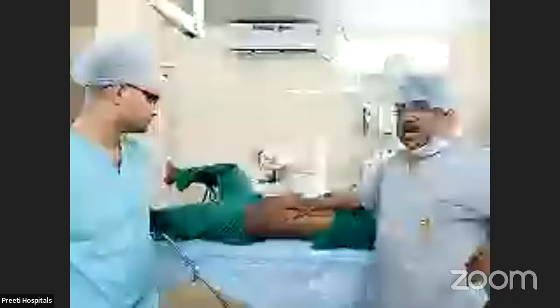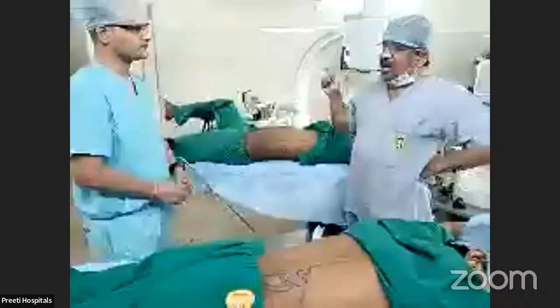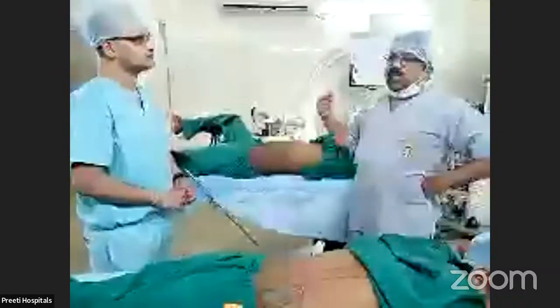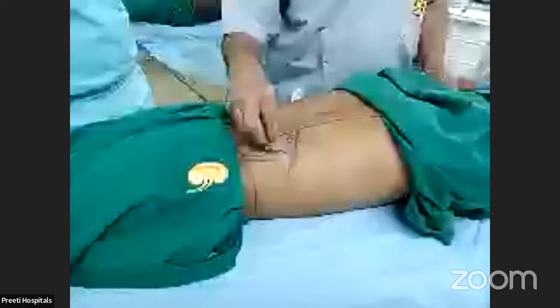So for all practical purposes, an inferior calycial stone is a disadvantage for supine PCNL. A large inferior calycial stone is a disadvantage for supine PCNL. A small inferior calycial stone is better for supine or prone. If you are comfortable with RIRS, do the major stone for the middle calyx. The majority of PCNL surgeons will not accept RIRS. It will add cost, and one more surgery is required. For a small stone, why would you want to take it out? You agree on this? Now, coming to the second combination, pelvic plus middle calycial stone.